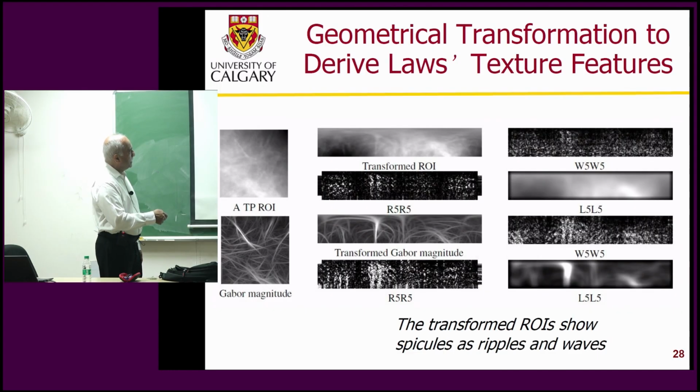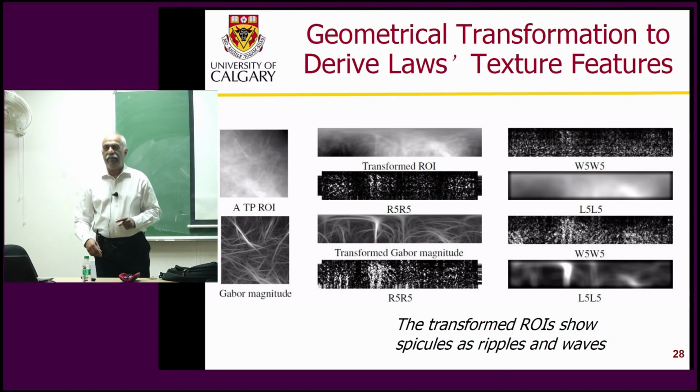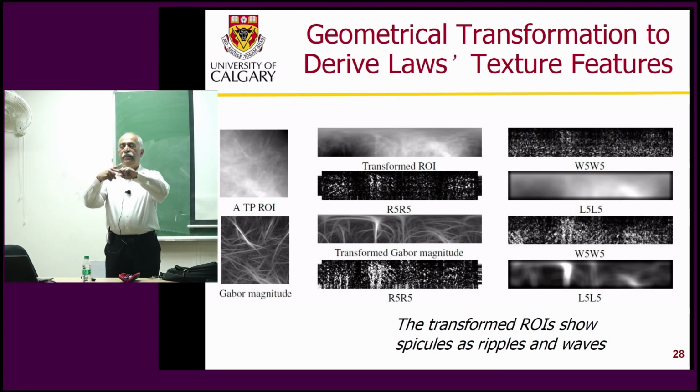What we expect is from the center of this node, there should be lines at various angles. Sometimes they're not from the center, but at a mathematically exact pattern of spiculating radiation will have multiple lines at multiple orientations intersecting at the center.